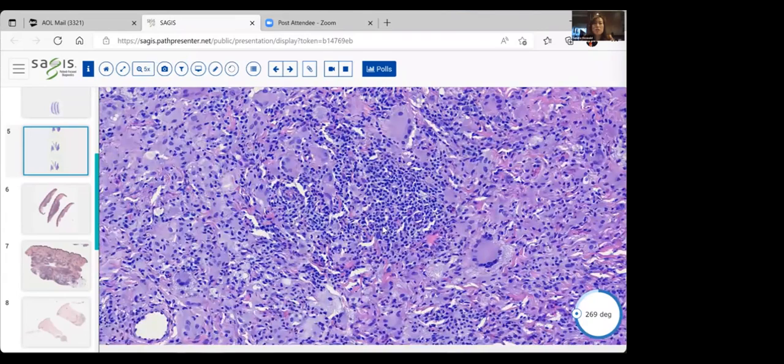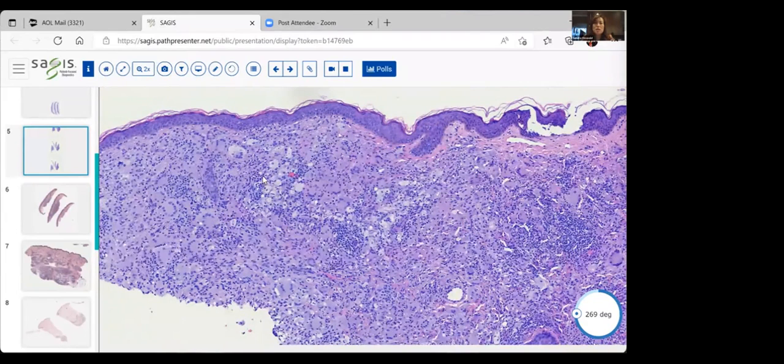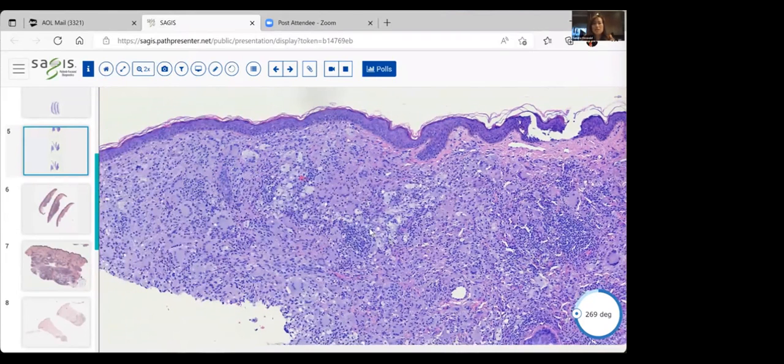This is a great example. As a matter of fact, when you pull outward of the magnification, you can see so many of these large foamy cell types. And from here, even at this magnification, you can see the formation of Touton giant cells here, here, and here. So please go back and enjoy these Touton giant cells.